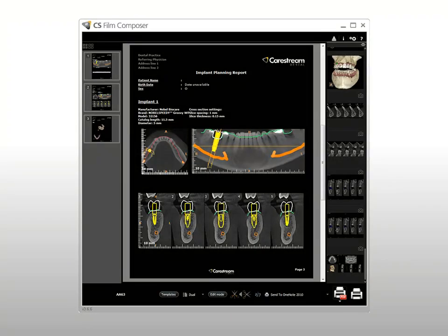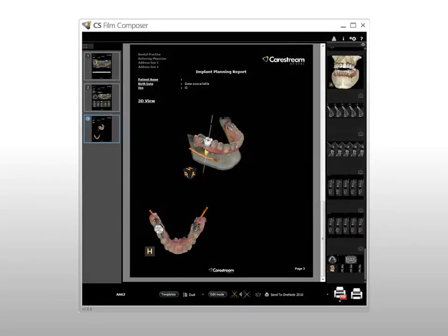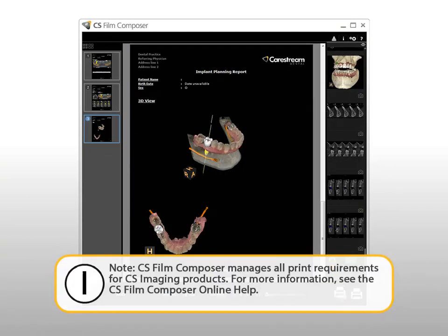Next, one page per implant with slice images and implant details. Then a final page showing 3D views. It is important to set the desired 3D view before generating the report, as the 3D image shown will correspond to the 3D view set before the report is created. Note: CS Film Composer manages all print requirements for CS Imaging products. For more information, see the CS Film Composer online help.